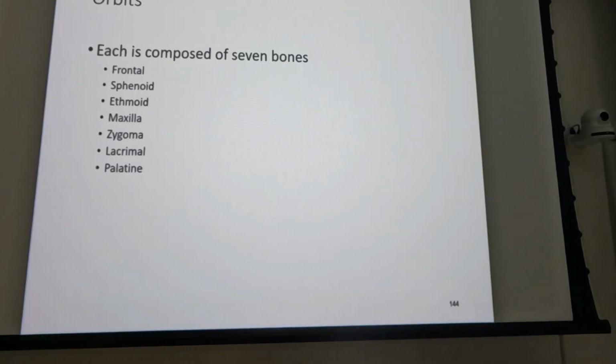But what's directly beneath that? Maxillary sinus, right? So the bone breaks out into the maxillary sinus, which has a very thin mucosal lining in the sinus itself, so it's going to bleed. And so on our facial bone series, we're going to look at two views that we can diagnose that.